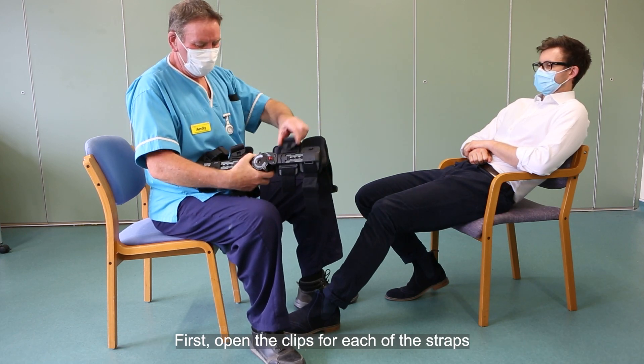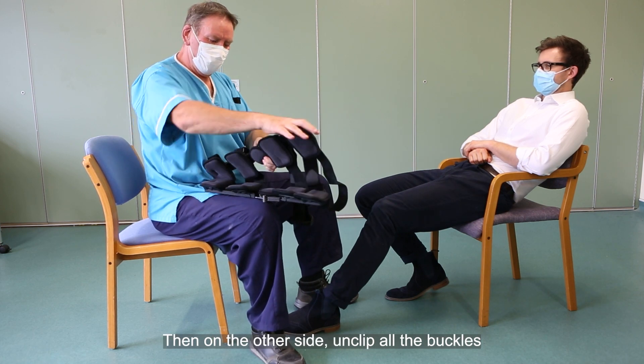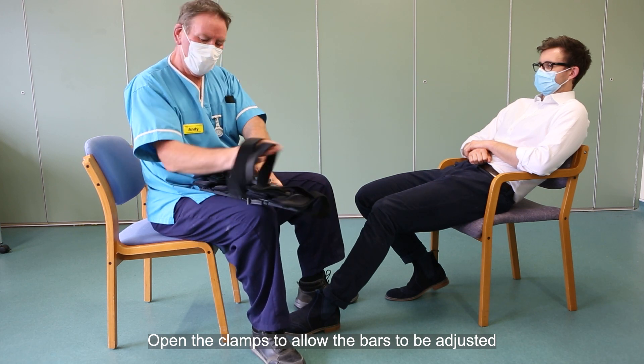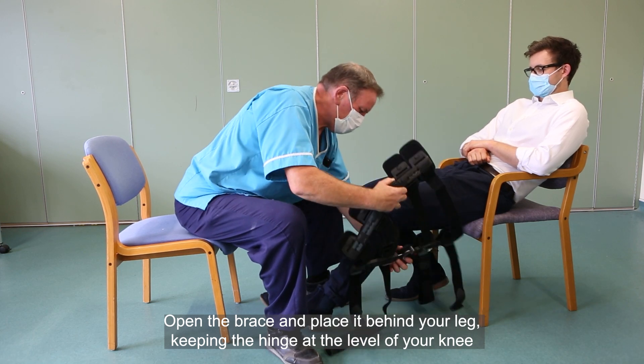First, open the clips for each of the straps. Then on the other side, unclip all the buckles. Open the clamps to allow the bars to be adjusted. Open the brace and place it behind your leg, keeping the hinge at the level of your knee.